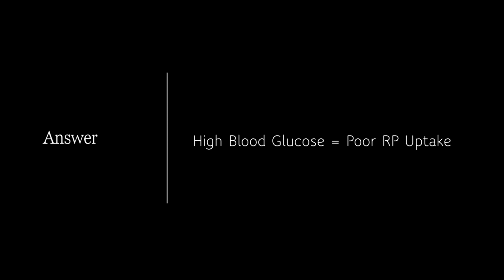Because if the patient's blood glucose was too high, the tracer will not uptake very well within the patient's body, and you will get very poor quality images. The high-end cutoff for this patient's blood glucose at my site was around 210 milligrams per deciliter. The patient's blood glucose was 129, so it was okay to proceed with the scan.